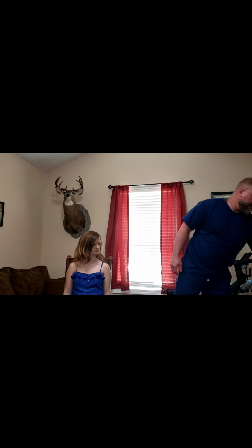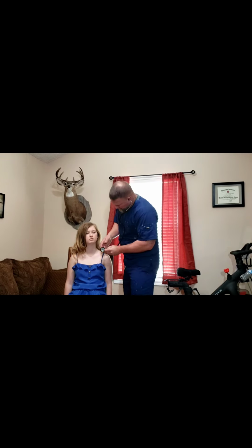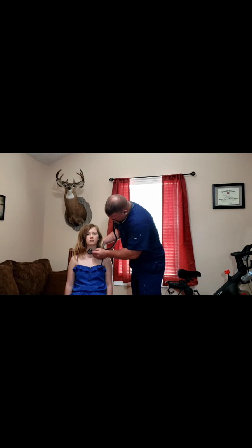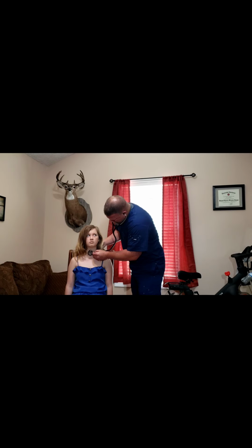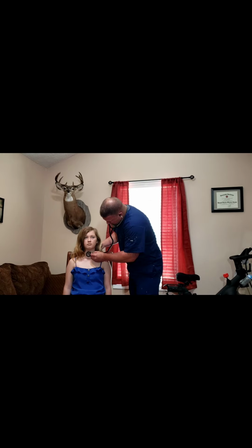So the last thing I'm going to do on the thyroid is I'll use the bell of the stethoscope to assess for any kind of bruit. I'll have the patient hold their breath to minimize any extra sounds that could be made. Hold your breath. Okay, there are no bruits assessed.